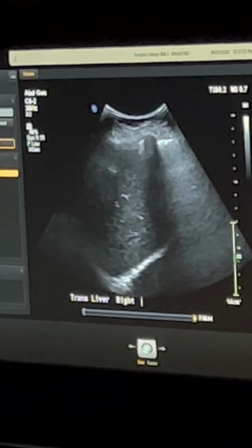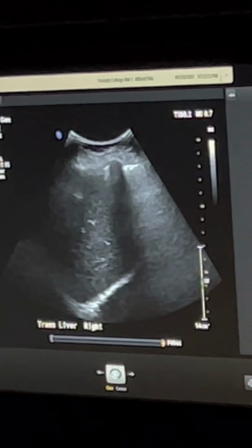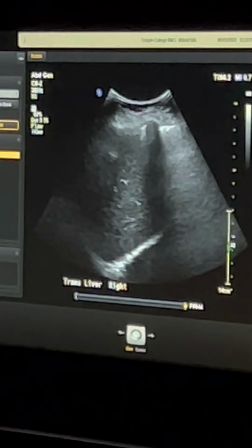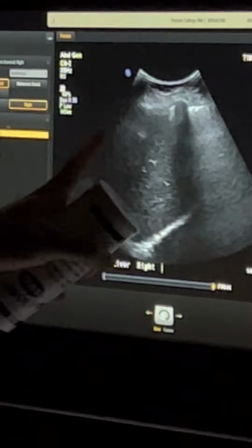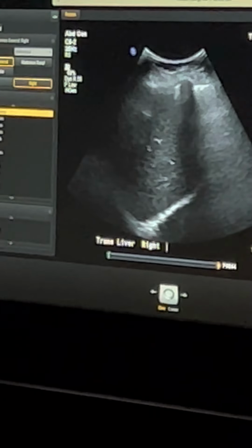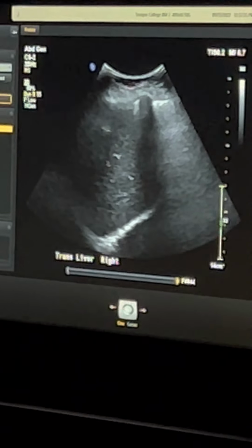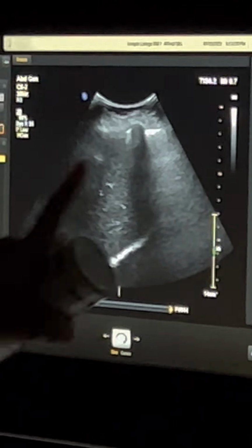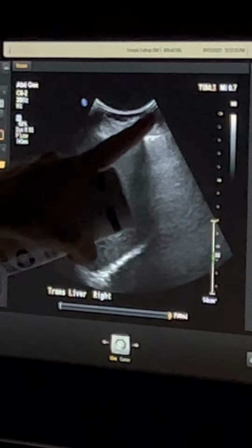So when you're doing intercostal, a good thing to try and do, don't glob a whole thing of gel, stick it and move it around a whole bunch, and then you're gonna end up still with these shadows. So find your window. We're gonna do a little dollop here, and a little dollop there, because that's where my contact loss is coming from.